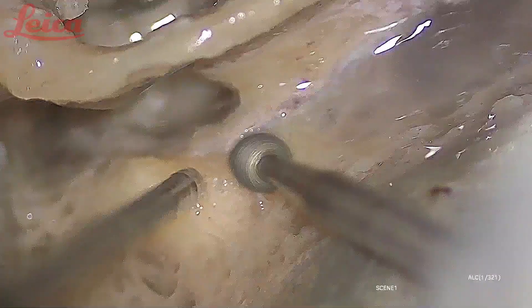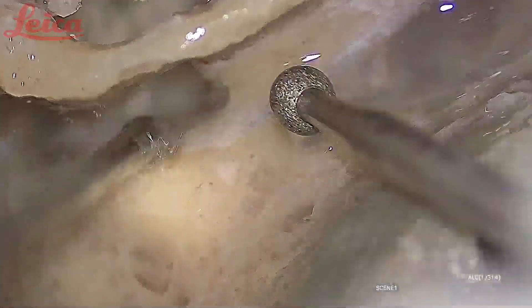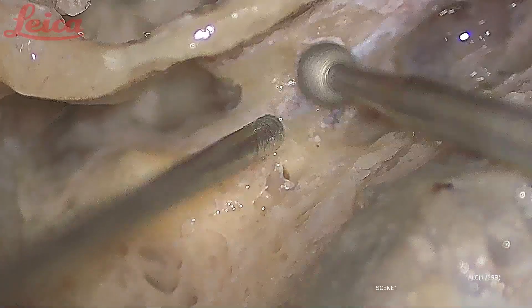There is still a little bit of bone around the vertical segment — I will drill that and then incise the sheath. For postgraduate students reading about Bell's palsy, there is a lot of controversy about the site of the lesion. One theory is that it is near the labyrinthine segment and that you need a middle cranial fossa approach for decompression, but you can see here that if the labyrinthine segment is involved, you can decompress it through this approach, or through the permeatal approach as popularized by Dr. Vijayendra.